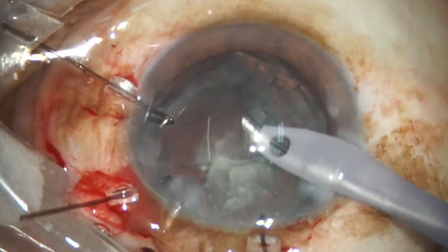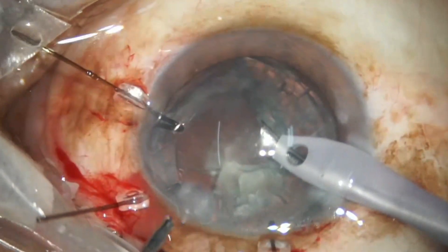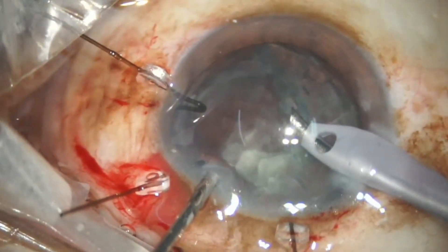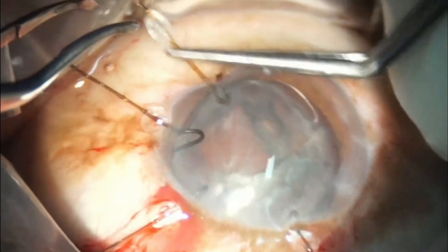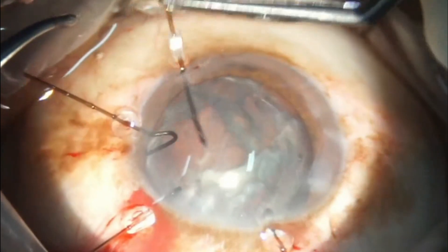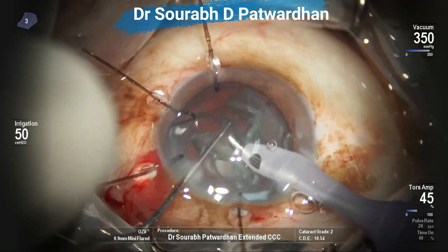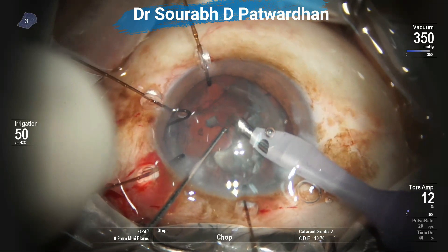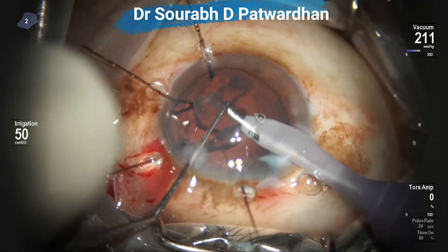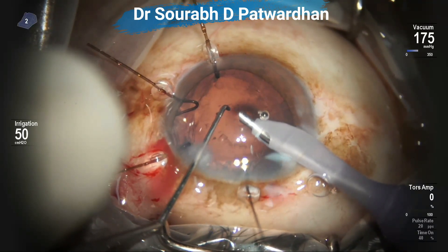Otherwise you might increase the zonular dialysis if your faco probe or IA probe catches hold of this loose bag. Many times it may happen that the zonular dehiscence may increase during surgery or you might have underestimated the area of zonular weakness — like in case of trauma, the zonular weakness might be more than what is visible preoperatively. Once I have inserted the extra capsular hook, the bag again becomes very well supported, and near the end I am reducing my vacuum to almost 150 to 200 so that I get a safe removal of the remaining pieces.